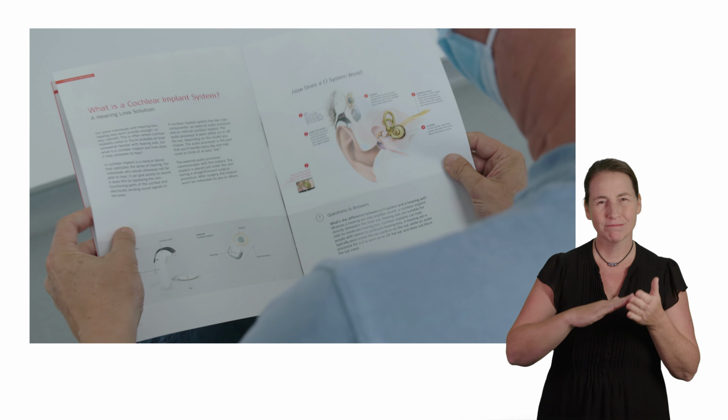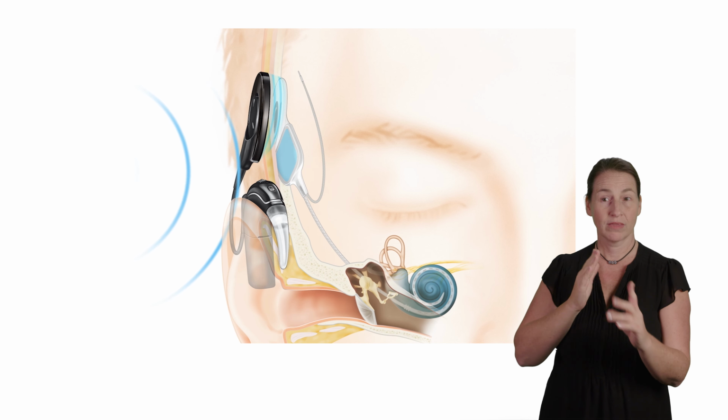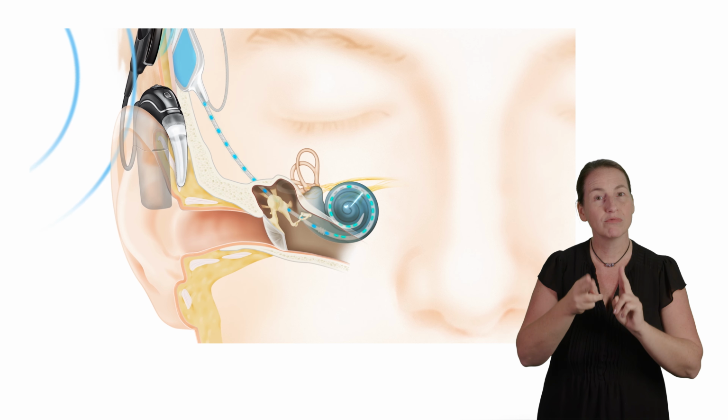Deafness can be experienced in different levels, and when we can amplify natural sound and enable someone to hear natural acoustic sound, we'll generally do that, and sometimes that involves using hearing aids or other types of amplification devices. Cochlear implantation comes into play when even the loudest conventional forms of amplification are not providing enough access to sound in a way that the brain can receive and understand. The cochlear implant replaces acoustic stimulation with direct electrical stimulation to the nerve that delivers sound to the brain, so that the brain can then, through rehabilitation, learn to interpret those signals as understandable speech and language.